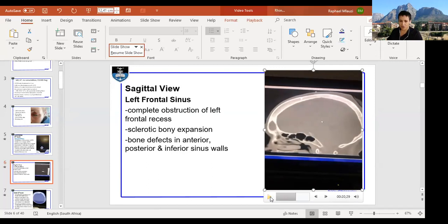So we did a drill out with a straight drill, because that was all that we had available in this case, from above and into the nasal cavity. I don't know if you've shown us surgical videos of this patient. I don't think you showed us anything, Raphael, but we actually did a combined open and endoscopic approach where we worked through the nose and from above. So that's also an option. Then obviously the cranialization and the osteoplastic flap you spoke about, and usually you would ask your neurosurgical colleagues to help with that. Maybe we can see if there are any questions from the audience.